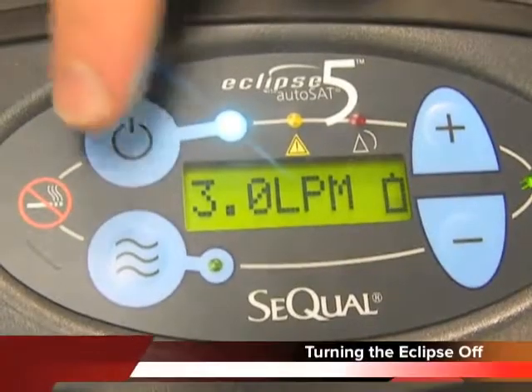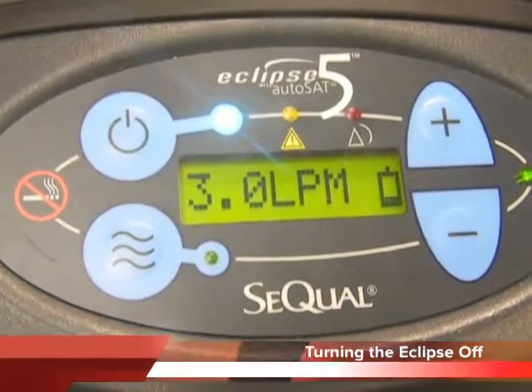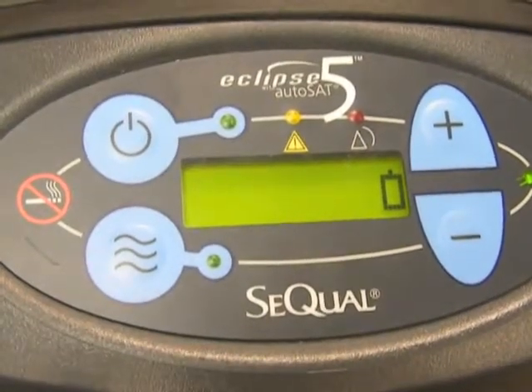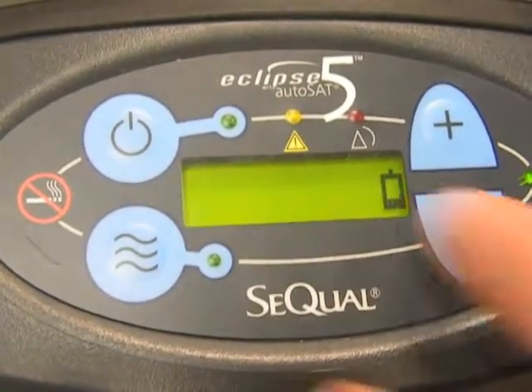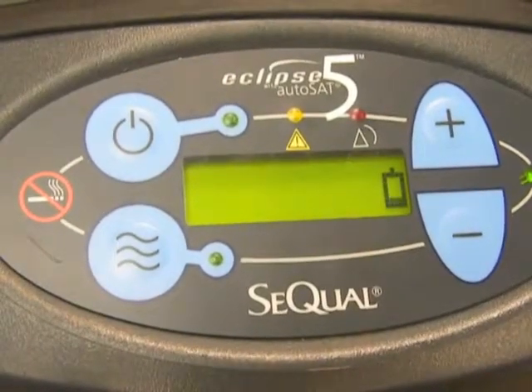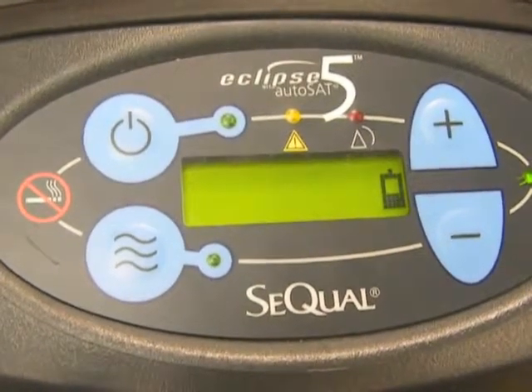To turn the Eclipse off, simply press the power button again and release it when the unit beeps. Now the machine is off. If you need to continue to charge the battery, that's fine, as you see by this icon here. There is no harm in leaving the unit plugged into a wall outlet for extended periods of time.